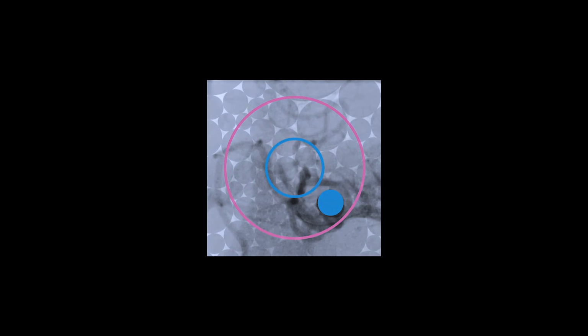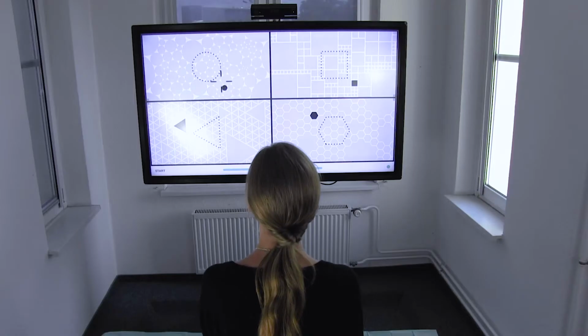The interaction steps during the diagnosis or treatment of an arteriovenous malformation served as the foundation for our secondary interaction task. It is difficult to precisely recognize details, such as the position of the catheter within such images. To get as much out of the images as possible, the radiologist should be able to zoom and pan into the region of interest. For image manipulation, we focused on panning and zooming, as it corresponds to one-dimensional and two-dimensional input and therefore can be transferred to a wide range of HCI tasks.